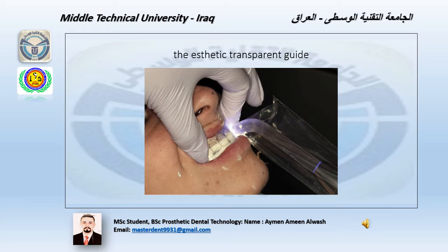Guide for selecting the appropriate denture tooth model. Overlay the aesthetic transparent guide into the existing denture.